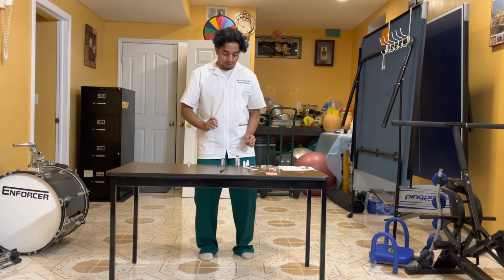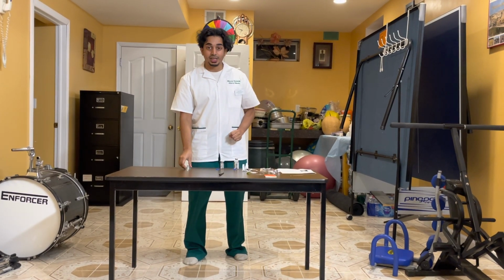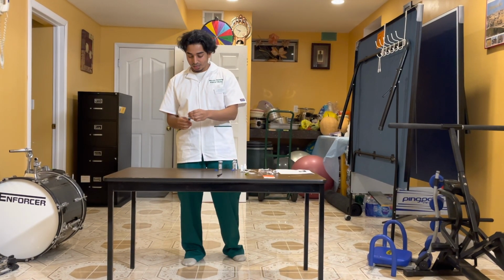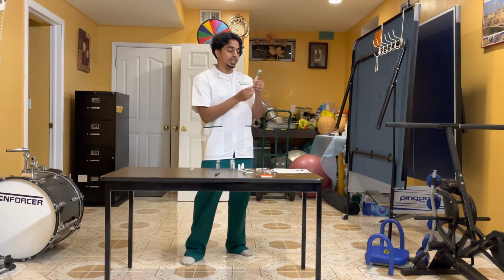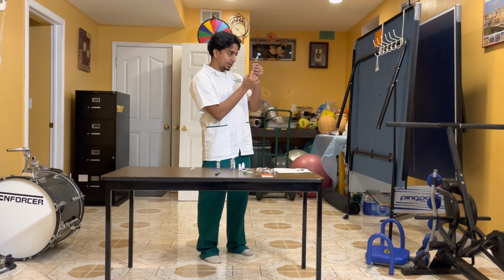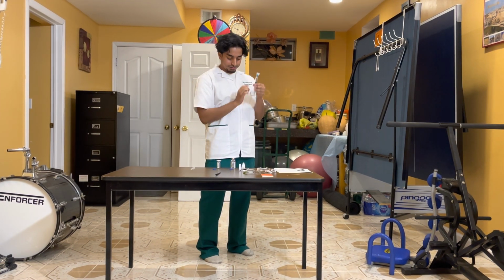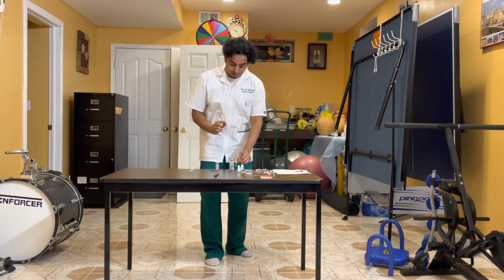Now that I have done that, I leave that there, and I'm going to be taking out the medication. I'm going to take out my syringe. First thing I'm going to be doing is drawing in air, 5.6 milliliters. Okay, perfect. And I'm going to be inserting this first into the normal saline.